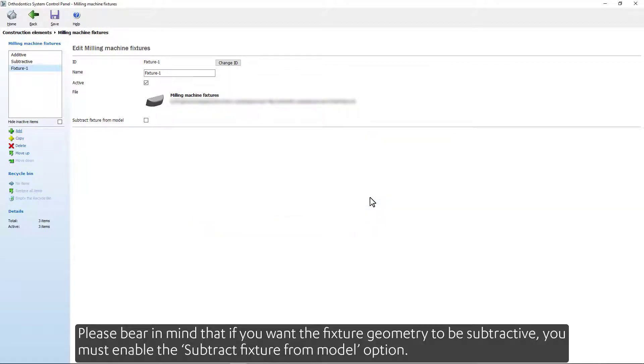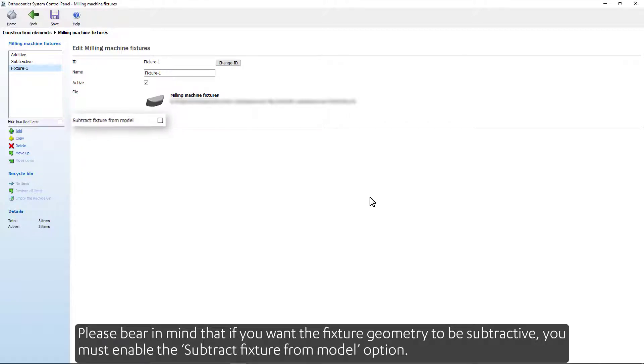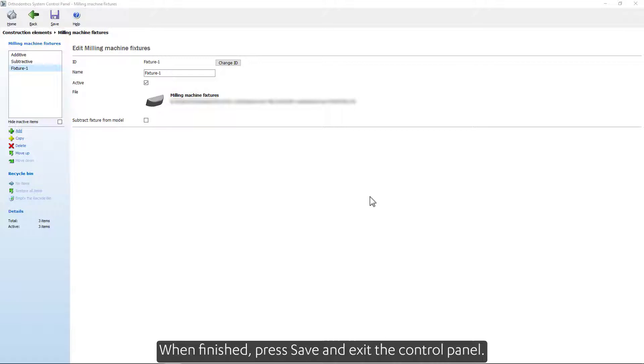Please bear in mind that if you want the fixture geometry to be subtractive, you must enable the Subtract Fixture from Model option. When finished, press Save and exit the control panel.